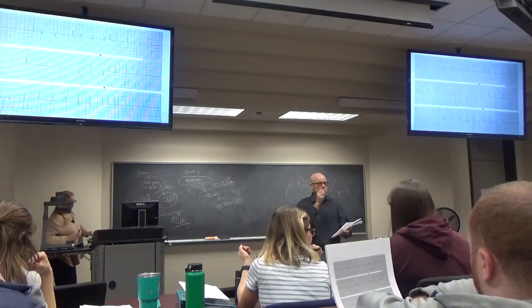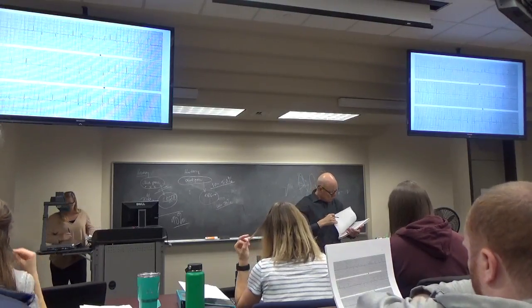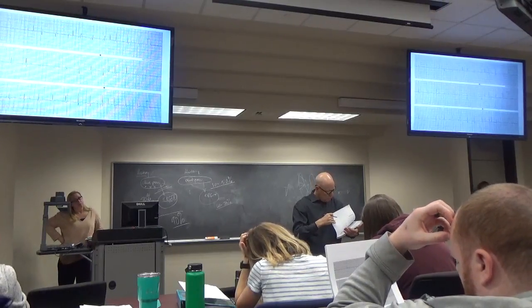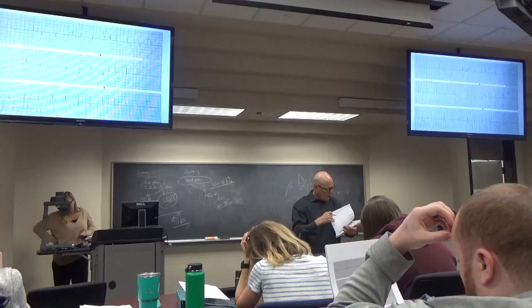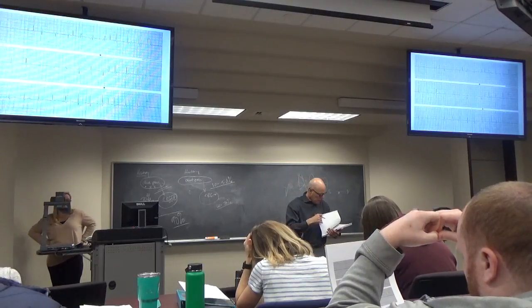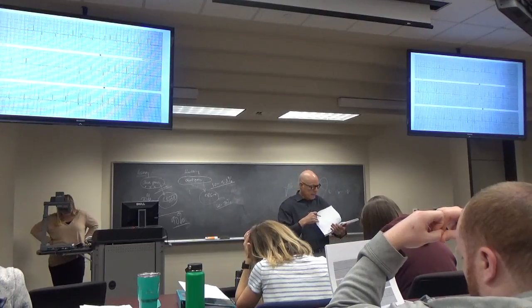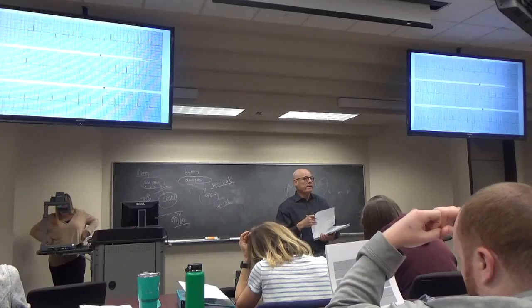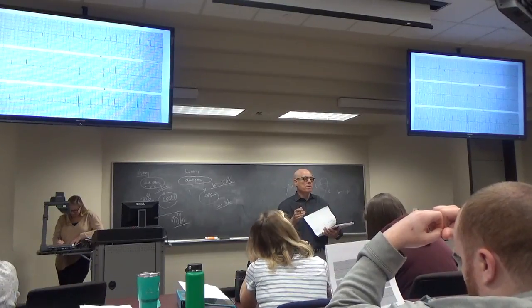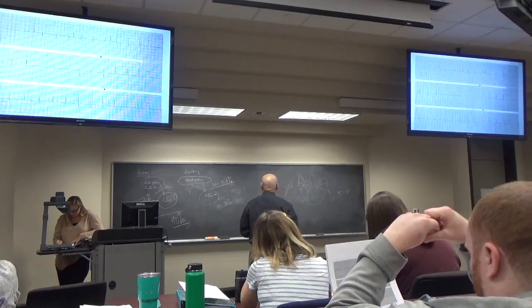Yes. Question. Given what we're defining as V1, V2, the P waves and whatnot, the RSR prime, how do you differentiate just left atrial enlargement versus aberrant atrial conduction? Oh, that's a good question. If you call this left atrial enlargement, you wouldn't be wrong. But you wouldn't be as right as if you recognized that P wave as being so weird looking. It must be coming from somewhere weird.